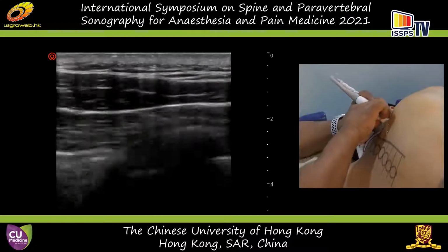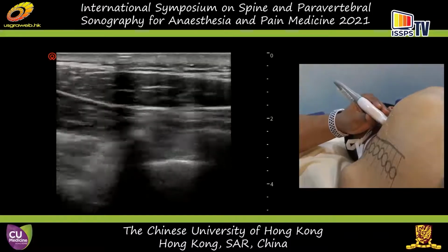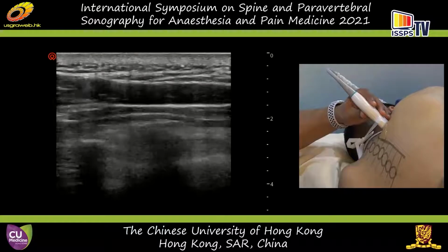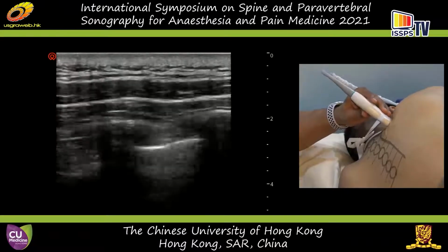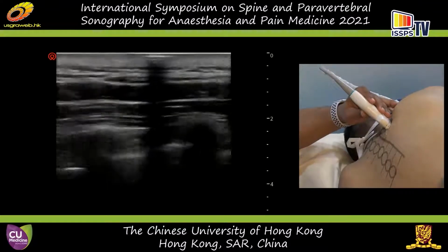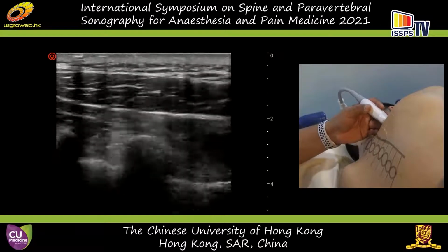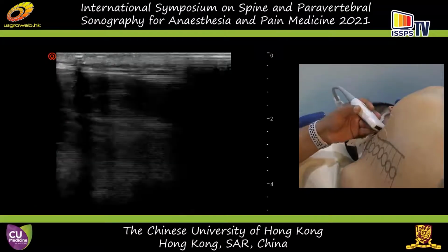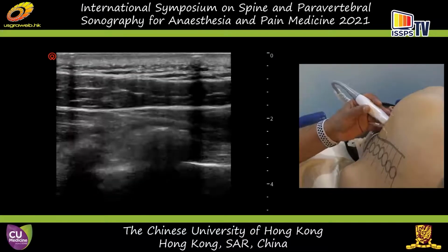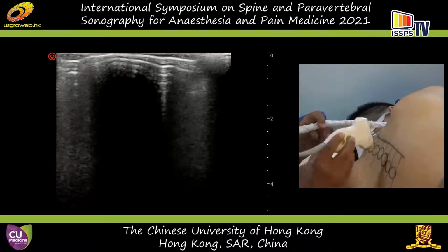Okay, so let's look at the first and the second rib. And then if I count distally, you will see the third rib will appear, okay, the fourth and the fifth. So accordingly you can count from, so this is a count down method. So you can count down from the first rib to more distally, okay? As opposed to counting up, you can also count from the 12th rib and count your way upwards.